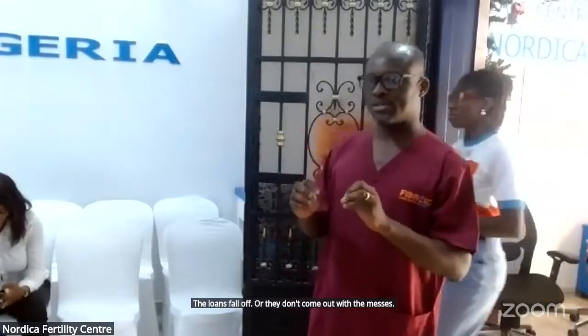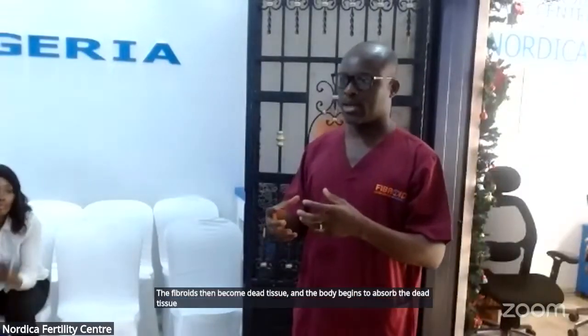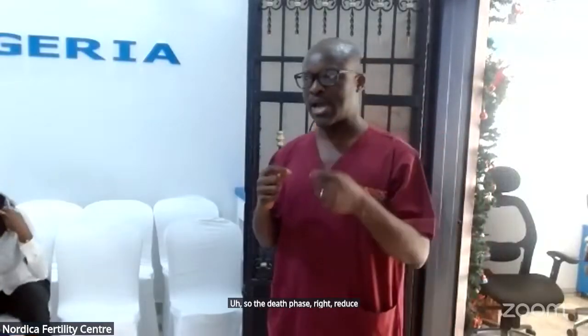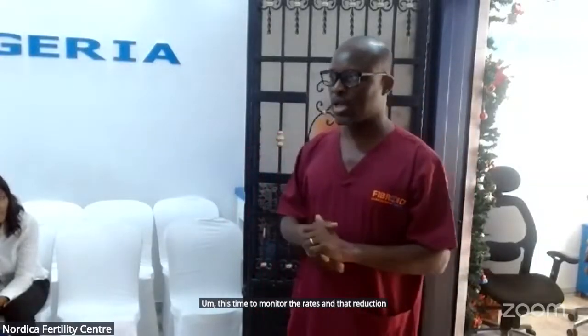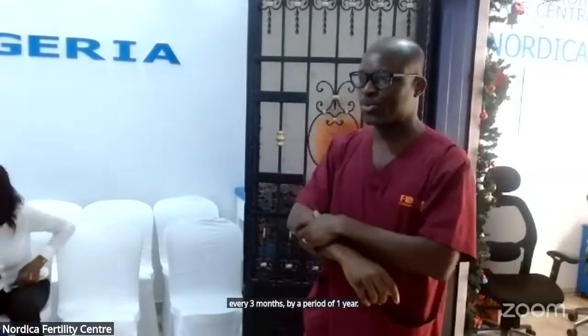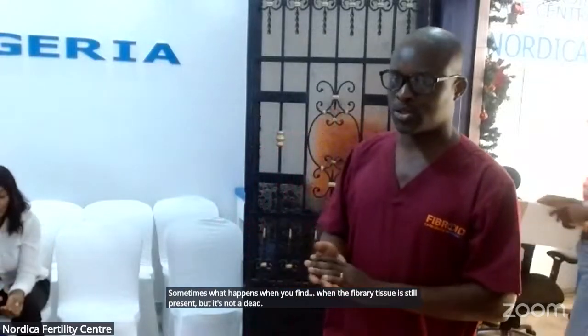The fibroids become dead tissue and the body begins to absorb the dead tissue gradually. The dead fibroid begins to reduce in size over time, and we do scans to monitor the rate of that reduction every 3 months for a period of 1 year.